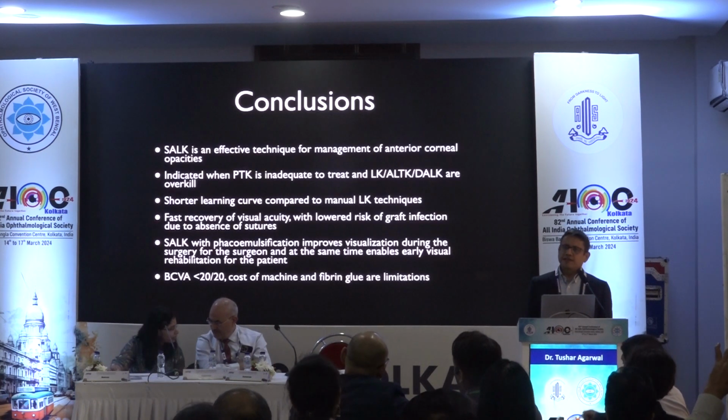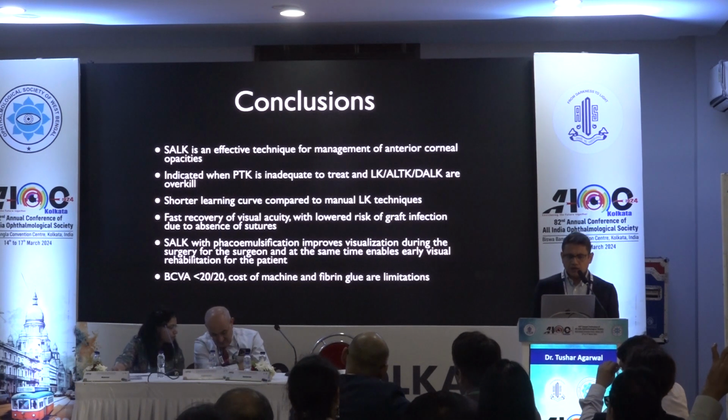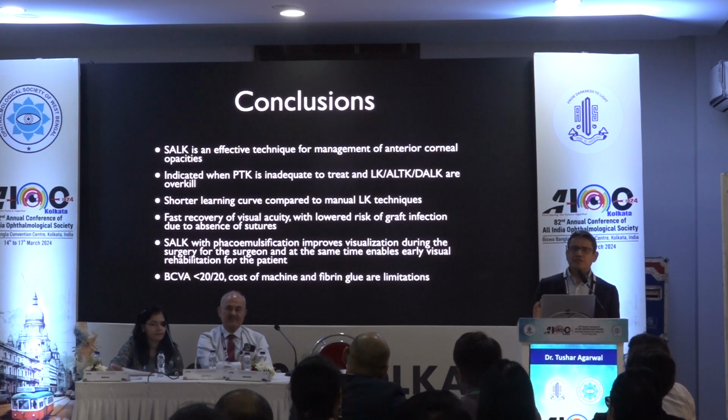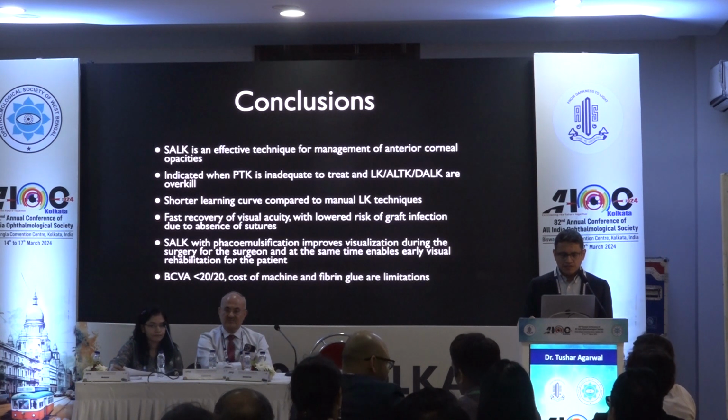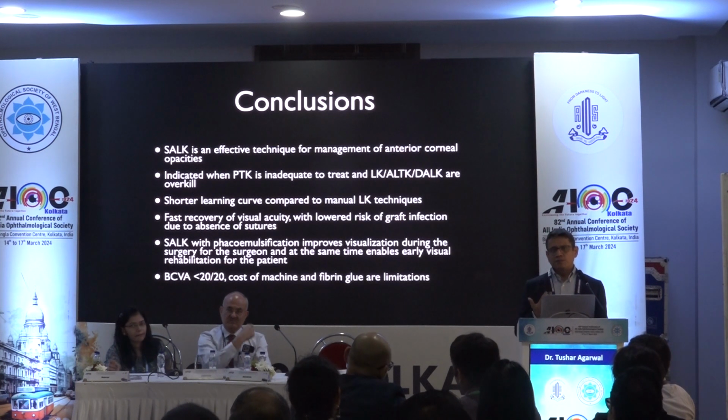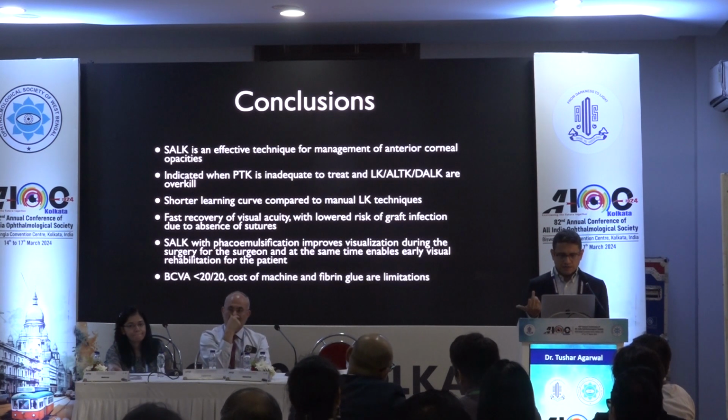To conclude, it's an effective technique for management of anterior corneal opacities. Its indication is where PTK is inadequate to treat the pathology, but the rest of the suture-based surgeries are an overkill. It has a very short learning curve compared to some other lamellar surgery techniques. There is a much faster visual acuity recovery with a lower risk of graft infection because of the absence of sutures. When combined with phacoemulsification, it greatly improves visualization for the surgeon during the surgery.